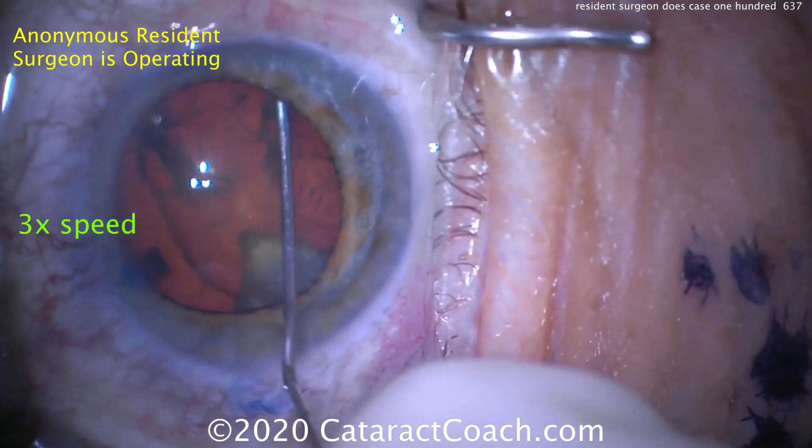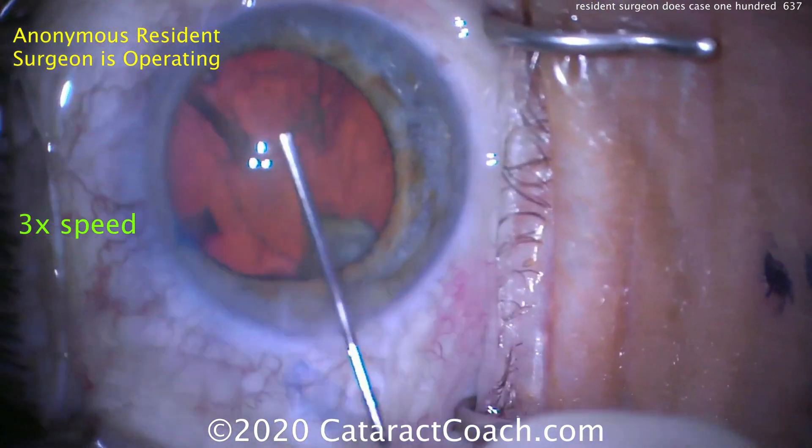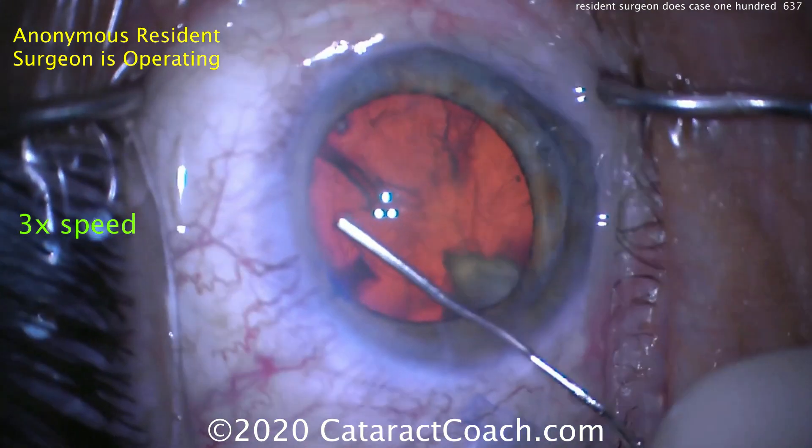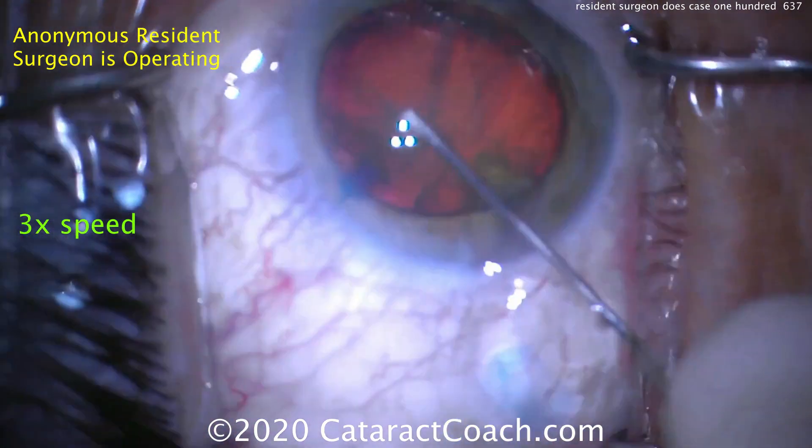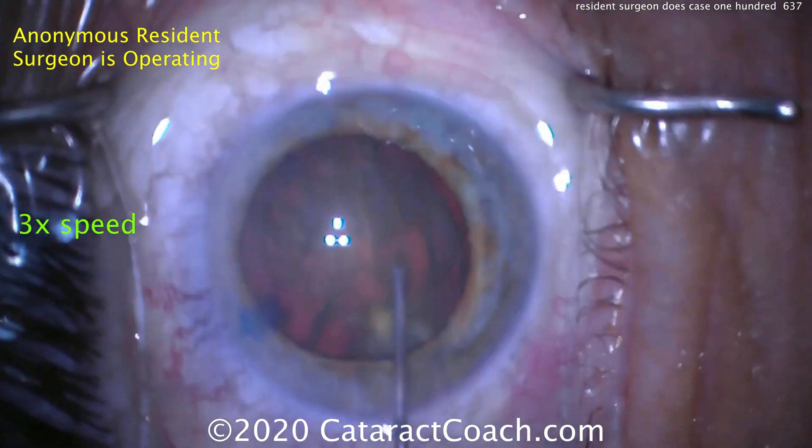A little bit of hydrodissection. Let's see if we see a good fluid wave. Maybe that looks okay — don't see a great wave just yet. Trying again. That's good. Beautiful wave.